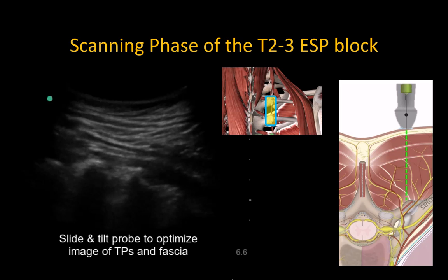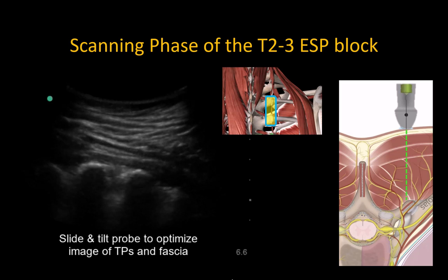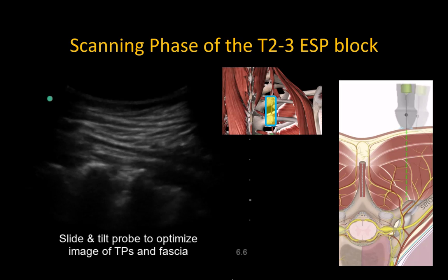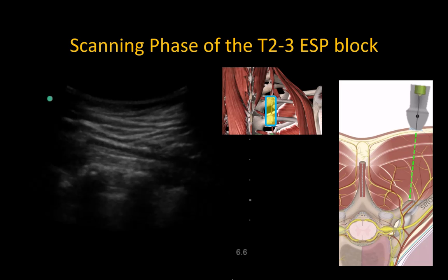The curved contour of the tip of the transverse process means that we may have to tilt the probe slightly medial or lateral to get a crisp, clear view of the hyperechoic transverse process tip. This angulation of the probe is one reason that it can be subsequently tricky to align and visualize an in-plane needle, so you should note this angle and compensate for it when inserting the needle.